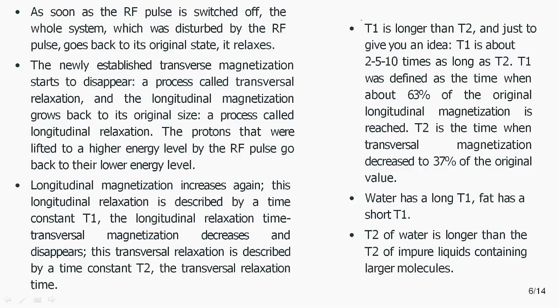T1 is longer than T2 because immediately as we withdraw that RF signal, that transverse magnetization disappears within a very short time period. So, that is T2.